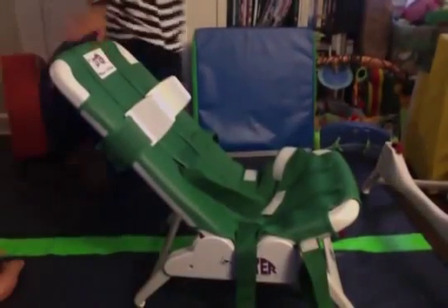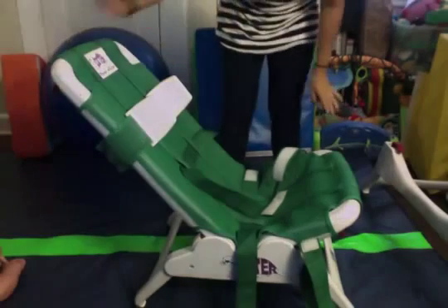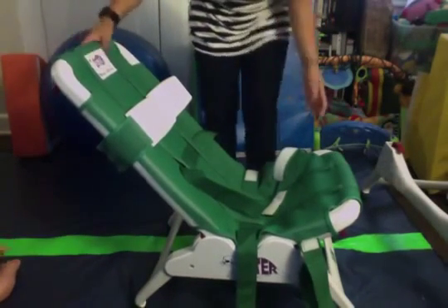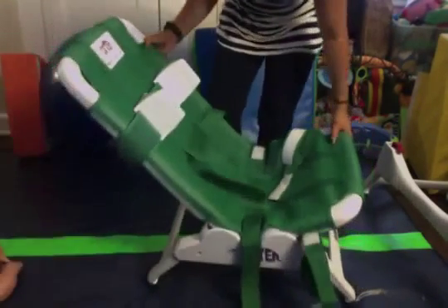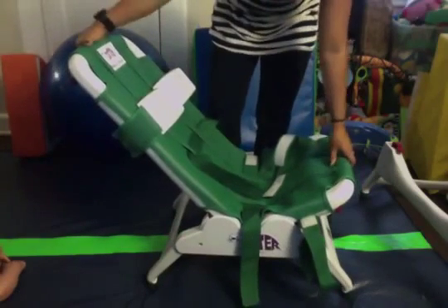Hello, it's Jess from Parker Meets World. Today I'm doing a review on the Otter bath seating system. It's made by the Winslit company — it says Winslit Rehab on it.